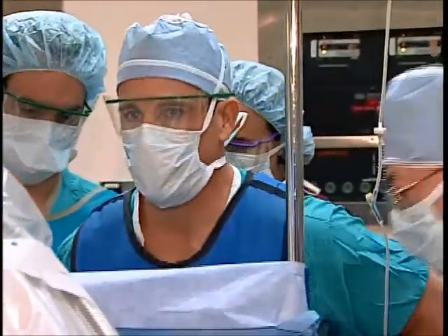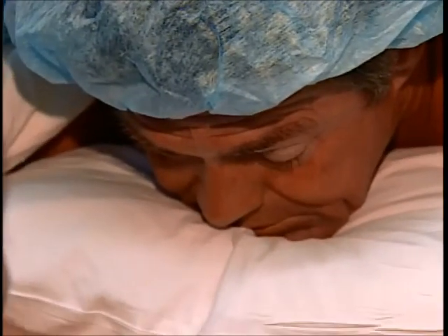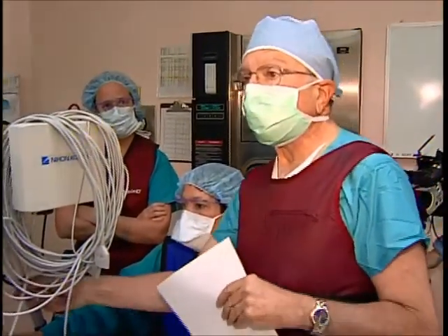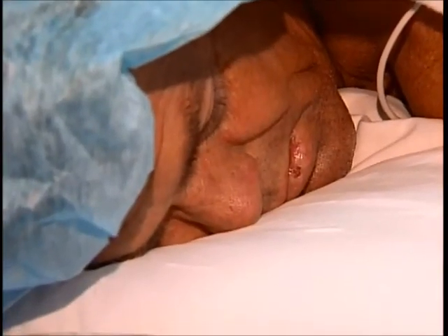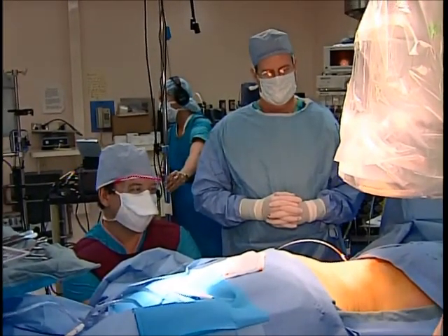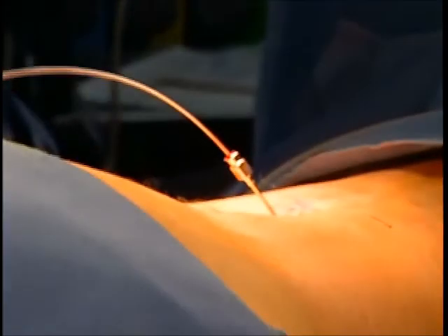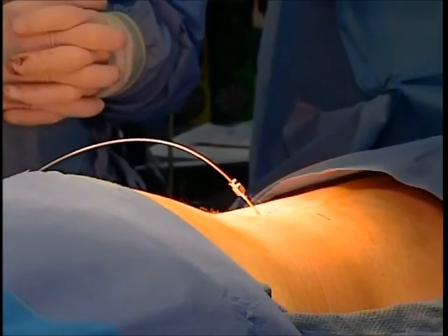Bill, I'm going to start to turn this on now. We're getting discharges at much greater than 5 hertz here. Incredibly, Bill begins to feel sensations as muscles are awakened that have laid dormant for years. They started adding some current to it, asking me questions, which was strange to feel muscles moving that hadn't moved in a long time.